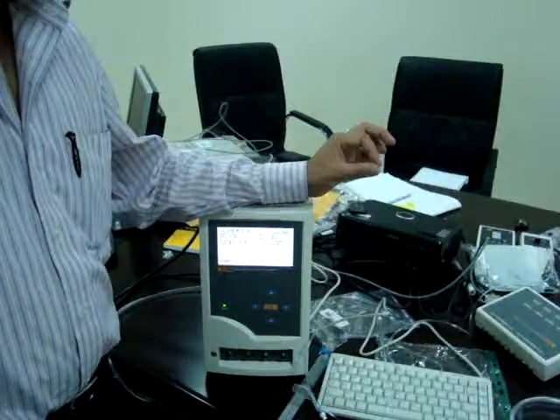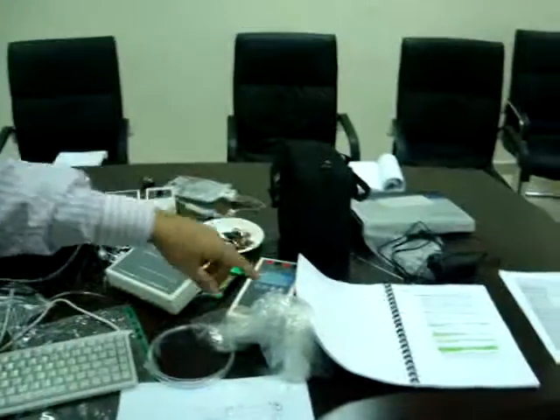Okay, this is for test. You are not going to do it in real life. You cannot use medical solutions on this machine. You cannot use medicated solutions. You are using only a solution prepared with deionized water or distilled water.